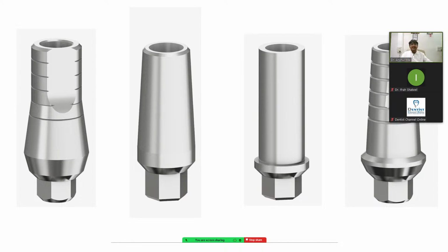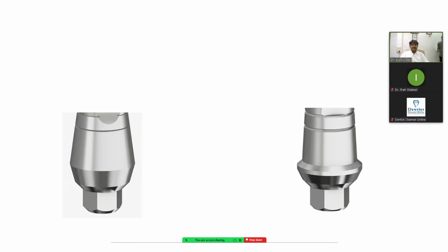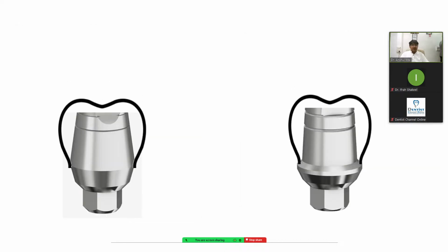Because of that there is no anti-rotation, and a completely polished surface is there on the top of it. So the laboratory person just taps it, and it acts on a friction basis, so there is no need for luting cement, and it becomes a cold weld and acts as your custom one. On the top you can cement it and create the crown. So you can create your emergence profile and everything whatever you want. The same way, as I told you, if I have a PFM crown, the margins are open and there is a maximum chance of food lodgement. Here also food lodgement is there, but with slight cleansing it is automatically cleansed by the patient.